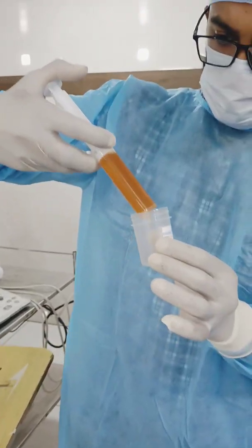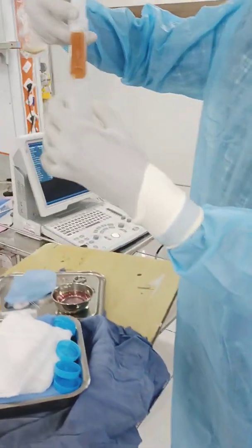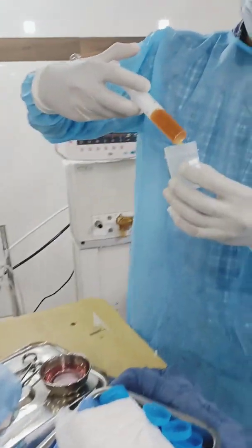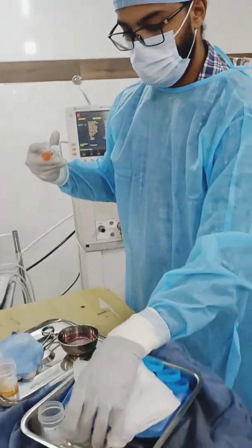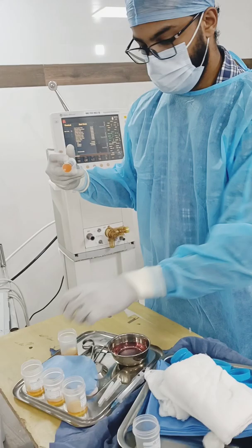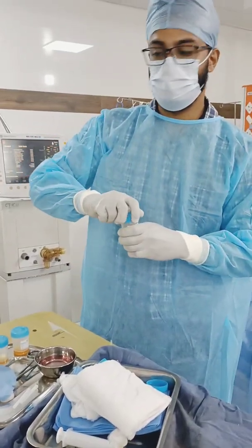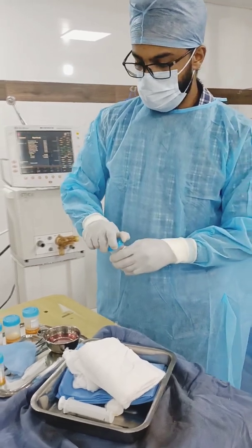Now I will pour 5 ml into each bottle. In total I will collect 5 samples for testing — sent for culture and sensitivity, microscopy, hematology, albumin protein, LDH and glucose, and cytology for malignancy and TB. And closing all the bottles one by one.